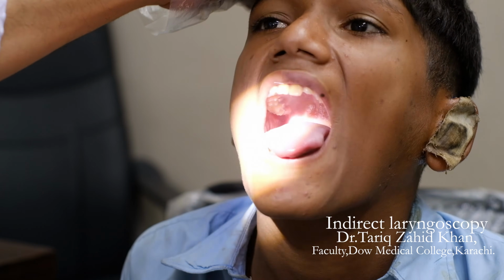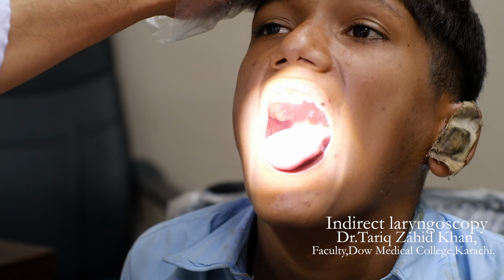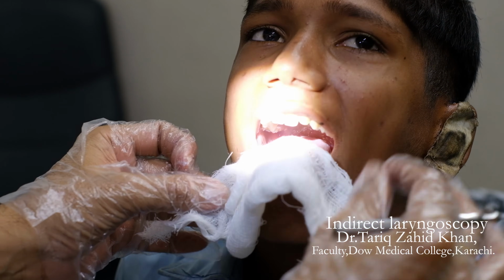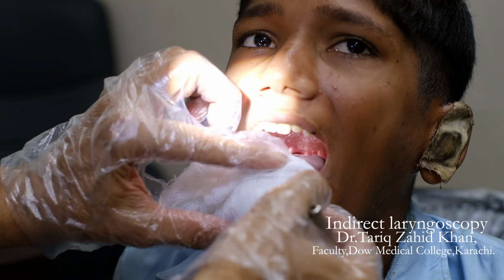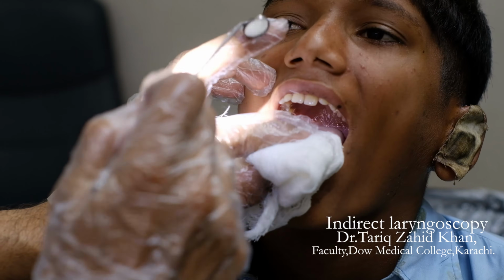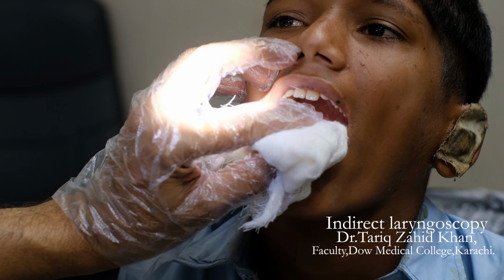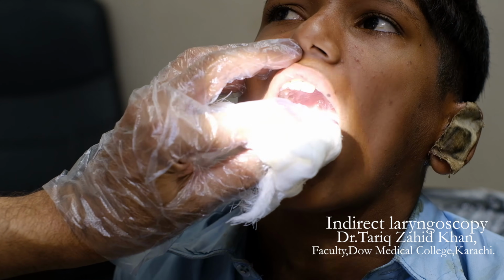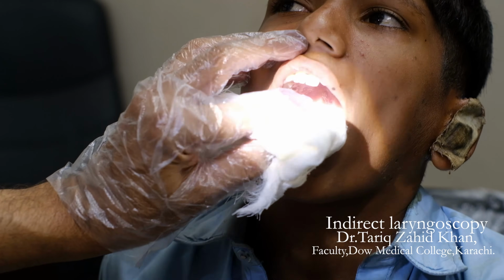Okay, open your mouth. Big mouth. Yes, protrude your tongue out, please. Okay. Now I will grasp his tongue like this, with the help of my fingers. You can use the index finger, as well as the ring finger or middle finger. Take deep breaths from your mouth. Okay, take breath. Very good.